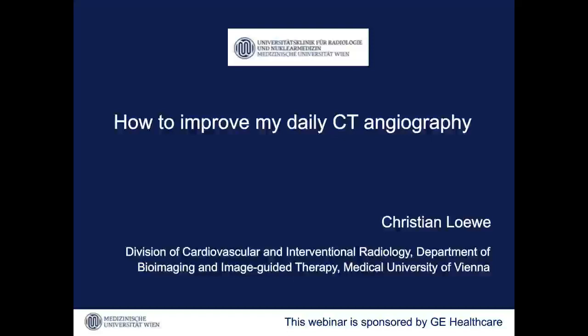So I would still go for CT first, and if you still are not able to safely assess the pathology due to calcifications at the lower leg arteries, I would try to add an additional MR angiography. Or I say, well, the patient is suffering from severe symptoms, I go directly to the angio, and I do a diagnostic angio ready to do a PTA in the same setting.